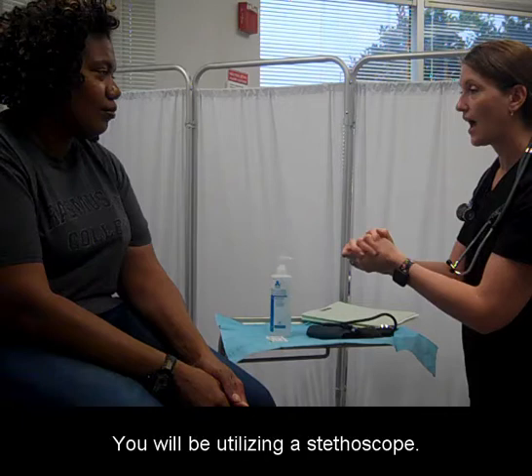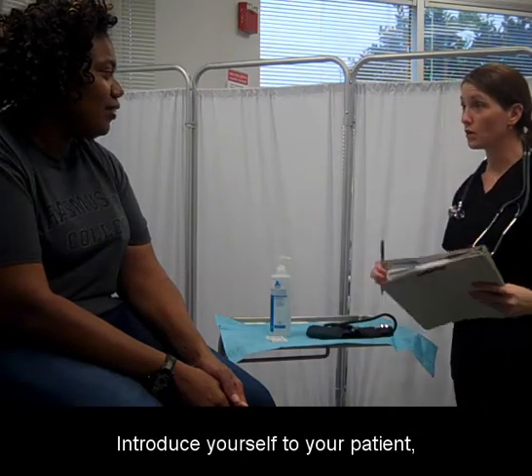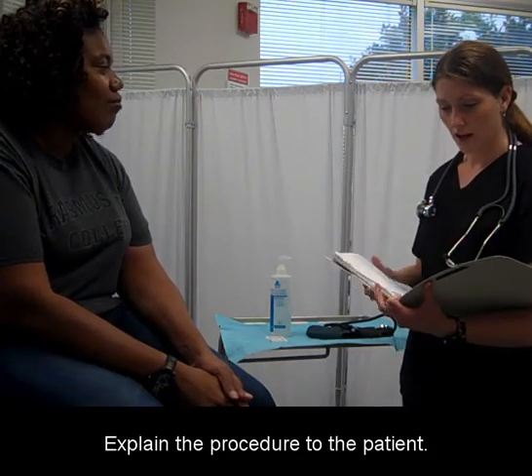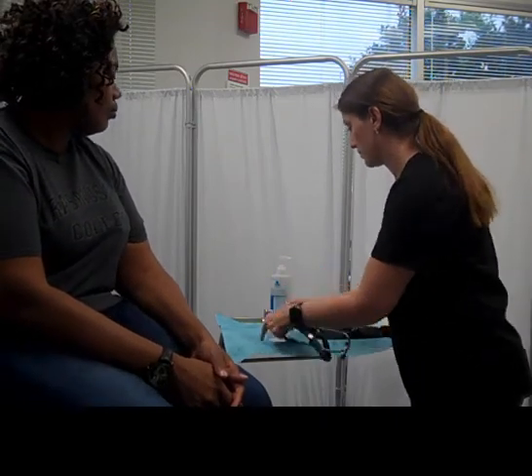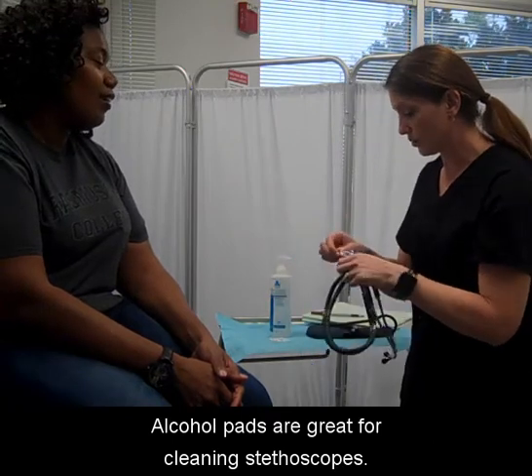You will be utilizing a stethoscope. Wash your hands, introduce yourself to your patient, and verify their identity. Explain the procedure to the patient. Ensure that all of your equipment is clean. Alcohol pads are great for cleaning stethoscopes.